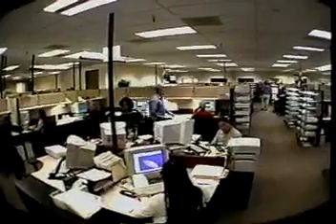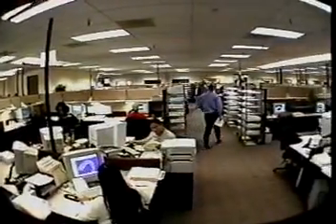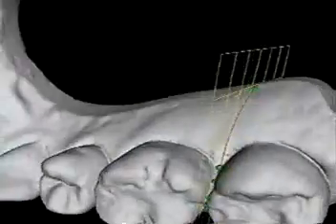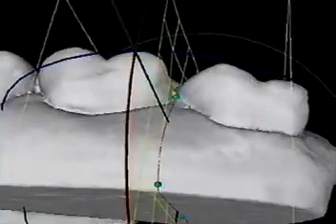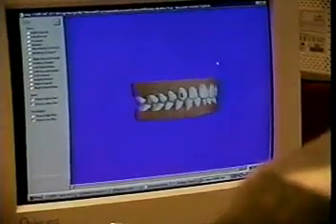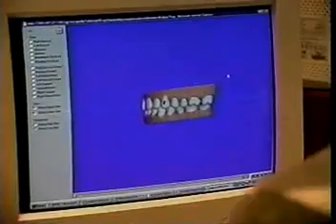This data is then sent to graphic designers who use a proprietary 3D computer graphics application to cut out each tooth and save it as a separate geometric unit. Once the teeth are separated and reassembled back into the gums, the designers create a final setup of what the patient's teeth will look like when the treatment is complete.